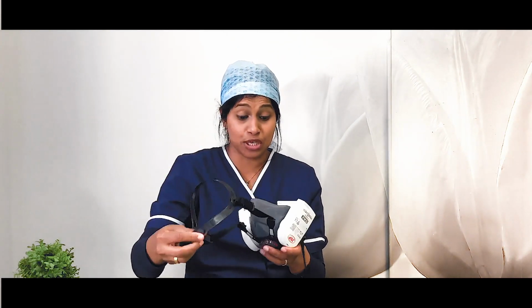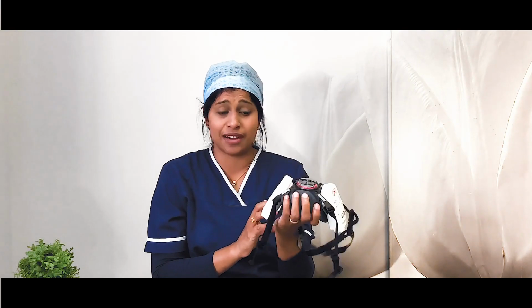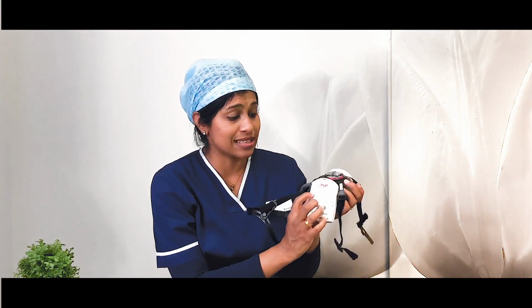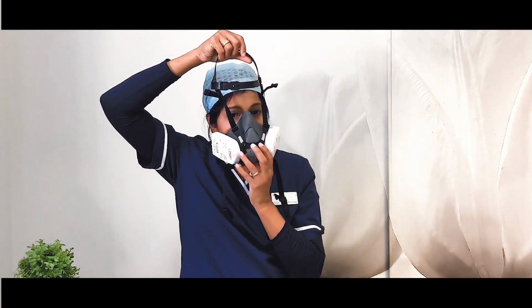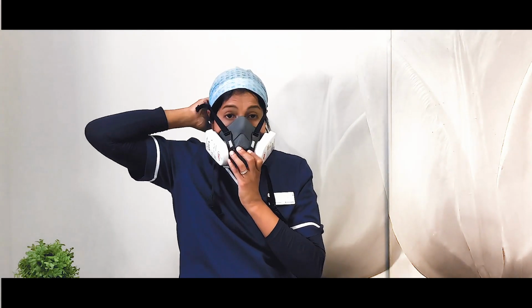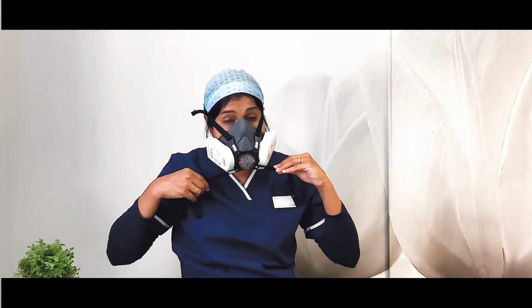Another type of half face shield reusable respirator is these ones from JSP. There is 3M ones. Again, they come in different sizes. These filters come again. So this is a P3 filter. You just need to change the filter, and these are reusable. So very similar. You just put it on. I could not wear my loops with this mask.